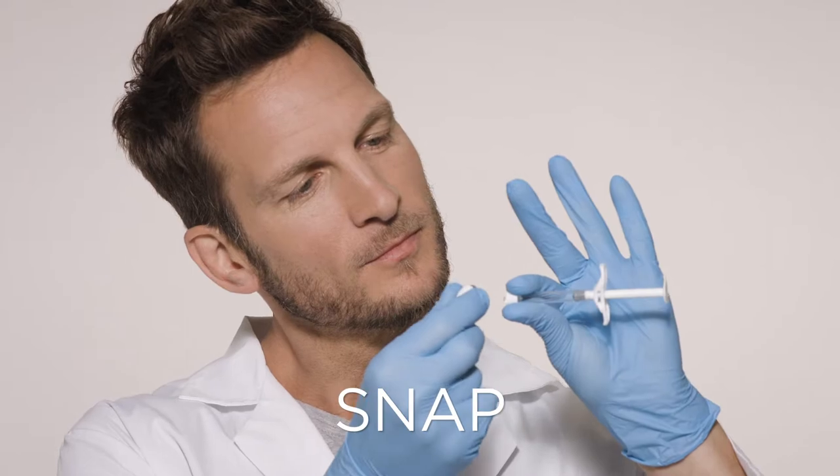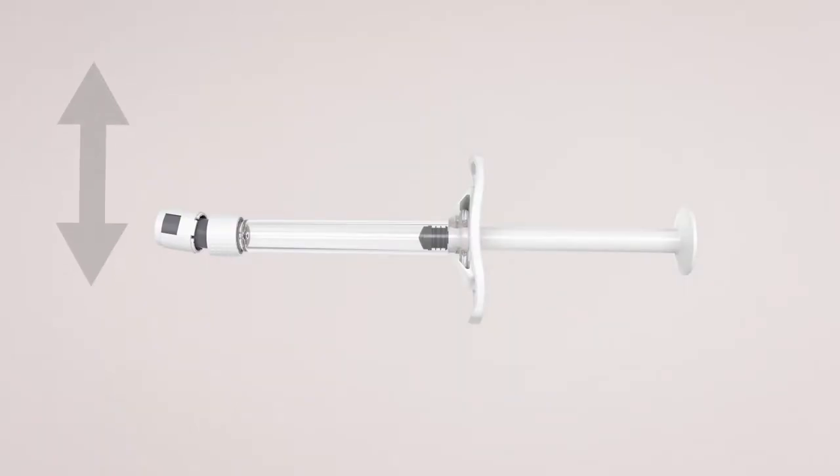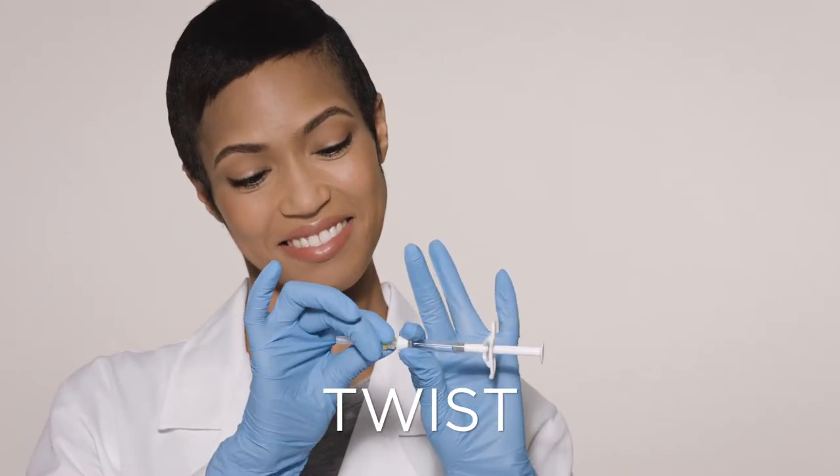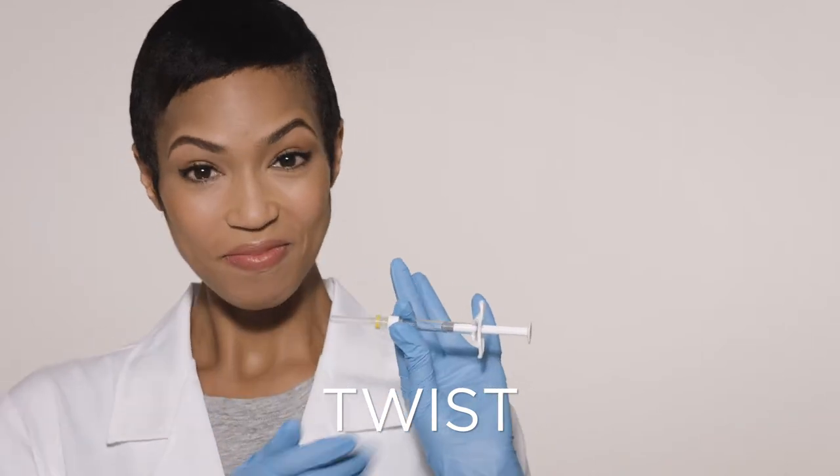While holding the luer lock adapter and syringe, snap off the tip cap by moving it back and forth. Still holding the luer lock adapter? Good. Now twist the needle clockwise to screw it firmly into place.